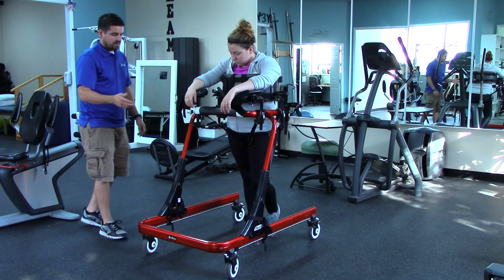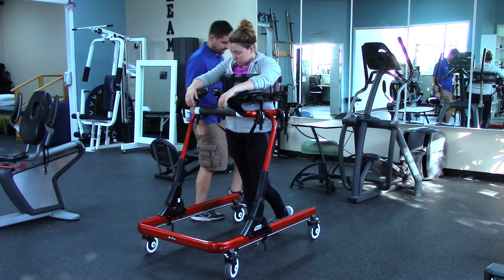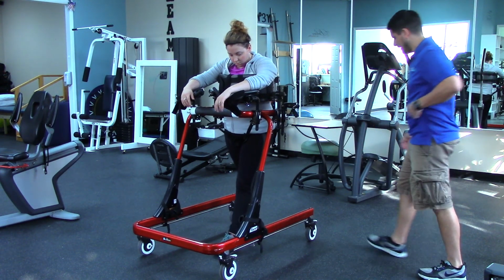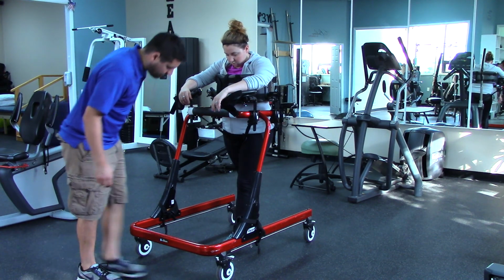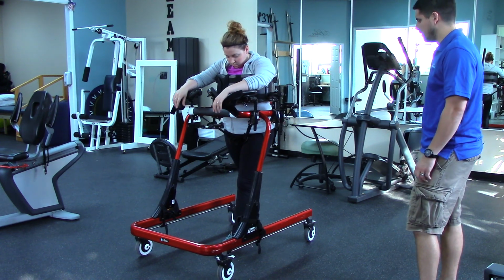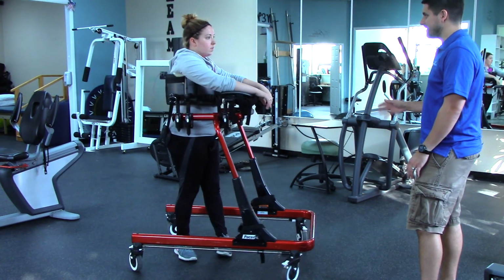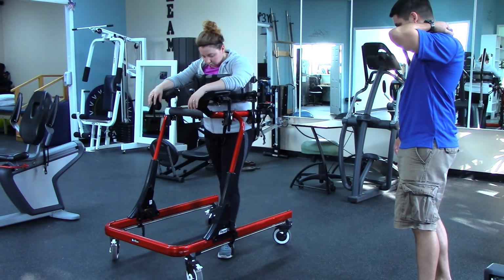Now from here, when we're actually doing gait training with somebody, when we're letting them walk in here, someone that's really trying to increase their endurance or something, you're going to be able to just let them go. Let me show you, this is without any drag, without anything on. You're free to do whatever you want. So you can go ahead and turn around. You can see it's a little bit difficult to manage. It's kind of heavy, so you're really having to put some effort into it.